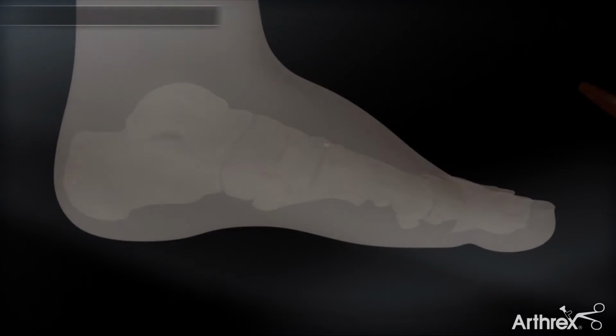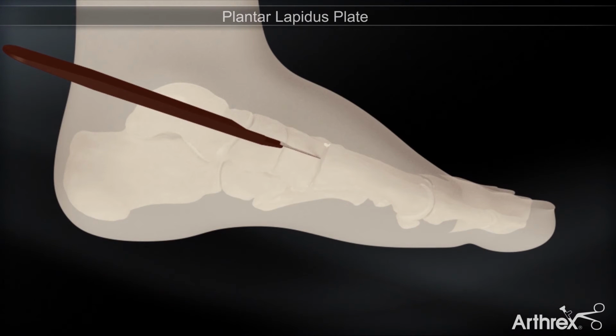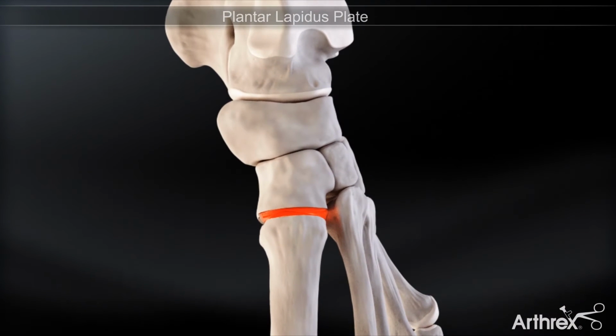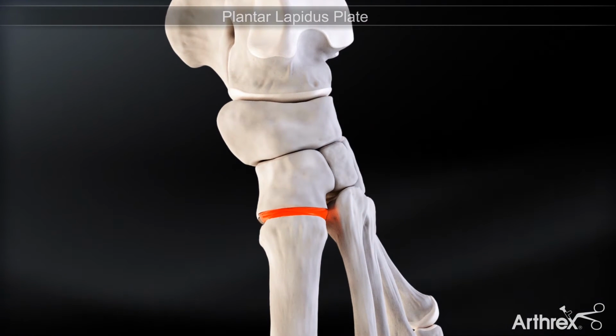Arthrex presents an arthrodesis of the first tarsometatarsal joint using the Arthrex Plantar Lapidus Plate. An incision is made at the medial aspect of the first tarsometatarsal articulation, being careful to avoid vital neurovascular structures. In addition, the tibialis anterior tendon should be identified and protected.